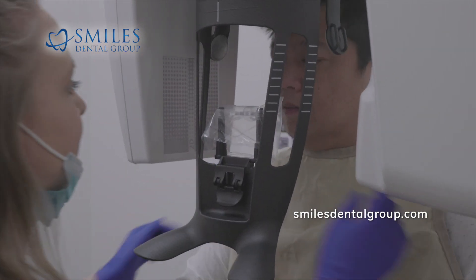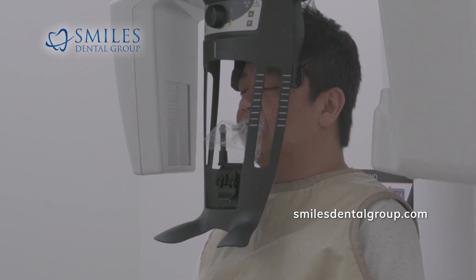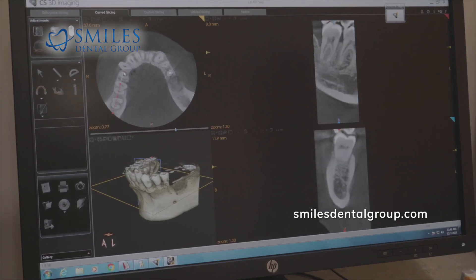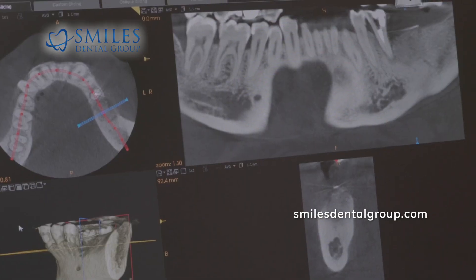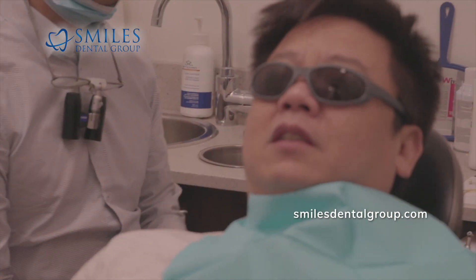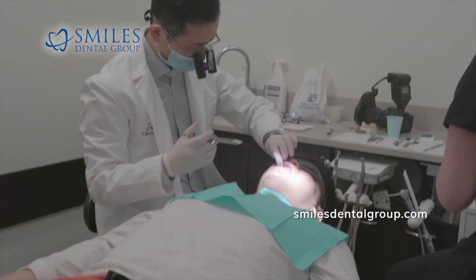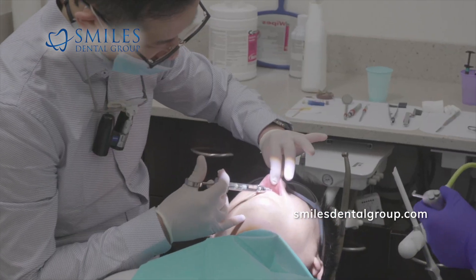So here we're taking a CBCT of Michael, our patient, because I previously did a bone graft for him. In the lower left quadrant, third quadrant, you can see it's a pretty fair-sized bone graft there. But the main reason for his visit to Edmonton is to complete his cosmetic work for his upper front teeth.